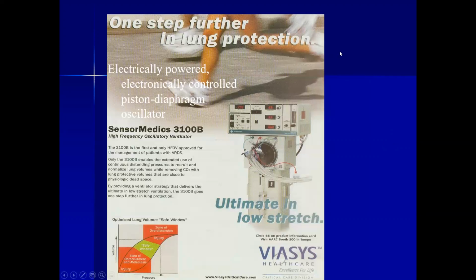I just put this here. It's an advertisement for the oscillator. And this is how they call the oscillator on your national exam. It's an electrically powered, electronically controlled piston diaphragm oscillator. They won't say the 3100A or the 3100B. That's the description that they use.